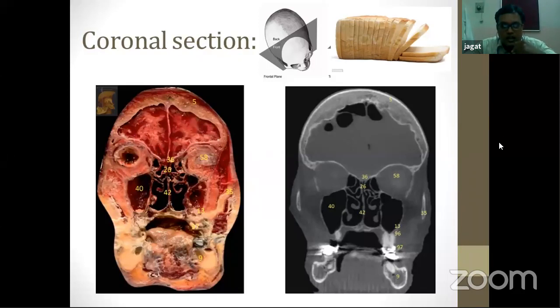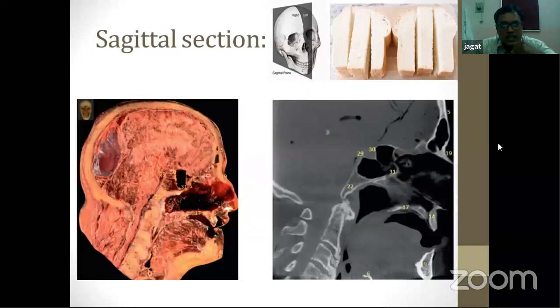The next one, the final third dimension, would be the sagittal section, just like cutting your bread loaves lengthwise from side to side. That's how we make breadsticks. They look like breadsticks. So take a look at the gross anatomy. You start slicing the head from one end to the other end. At this particular region, somewhere midway through the skull, you have made a section.